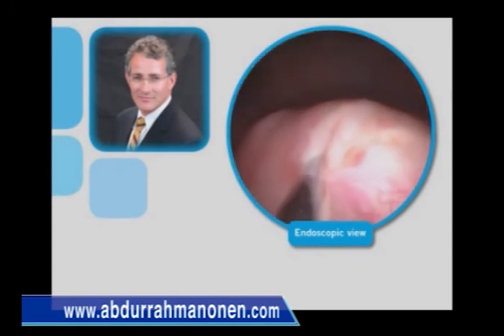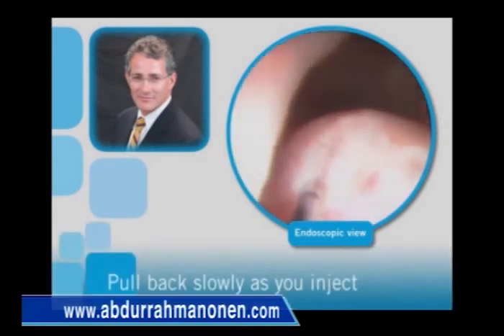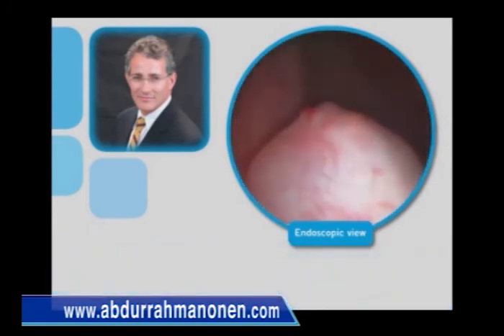Pulling the cystoscope back to the bladder neck will help identify improper technique, in that the deflux will be noted to move caudally and therefore out of the field.